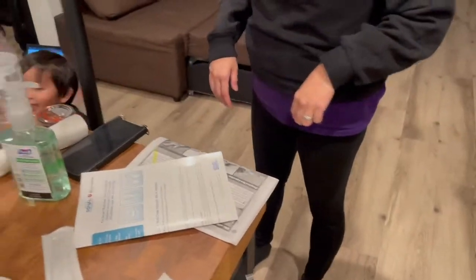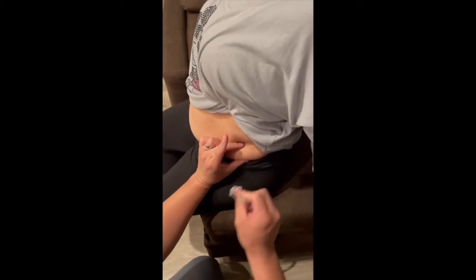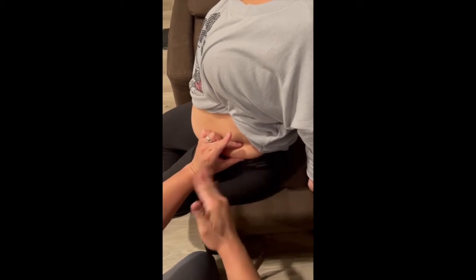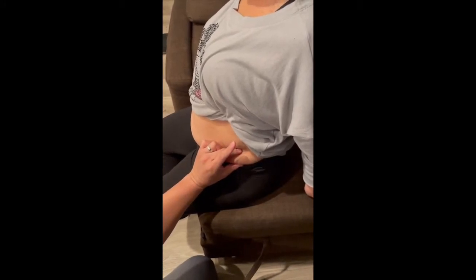You're fine. Can I move this? Yeah, sure. Put that down a little. So I'm going to go right here, okay? All you're going to do — you're going to hold it like this. Wipe it like this. Okay. Now if it's wet, it's going to sting when you pull it out. So just kind of fan and dry. And then it's going to be quick. Take this off. There you go — pull back. And then just make sure there's no air in there.